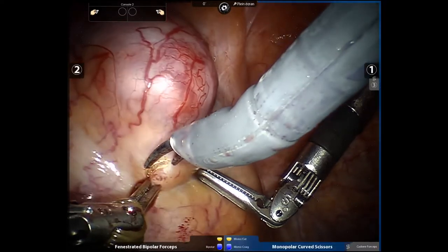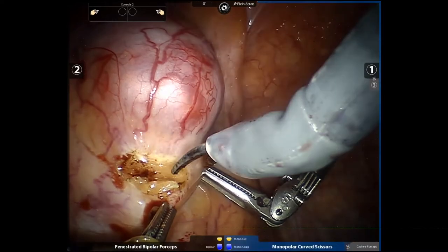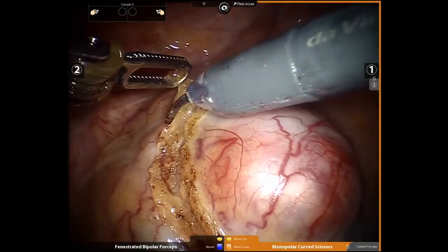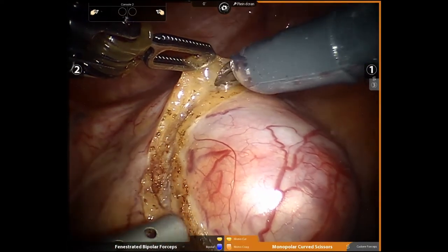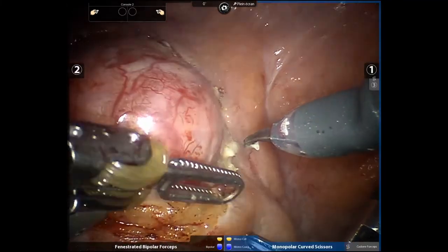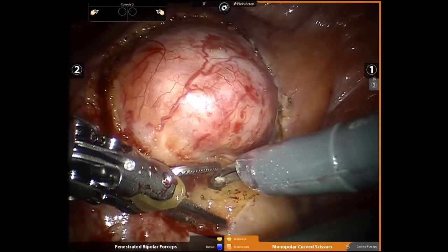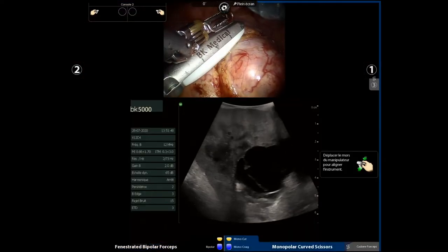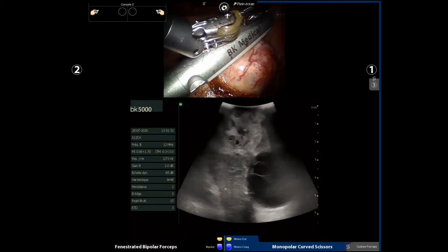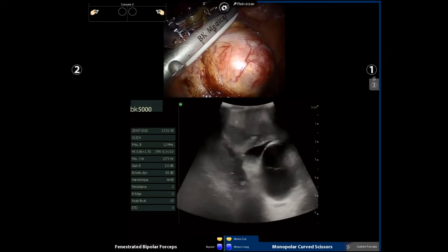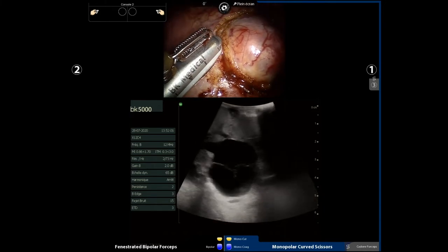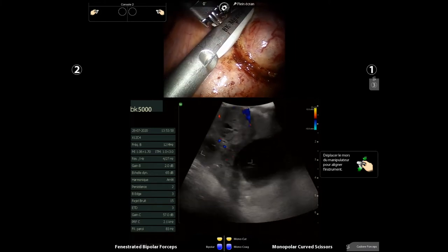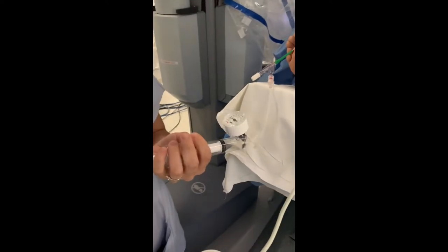The edges of the tumorectomy are then outlined before the partial nephrectomy. Real-time robotic ultrasound allows us to confirm the margins of the tumorectomy. Doppler shows the vascularization of the tumor before occlusion. The occlusive balloon is then inflated to its nominal pressure.